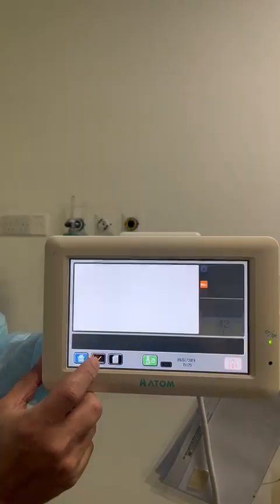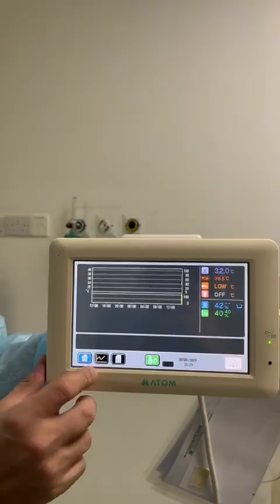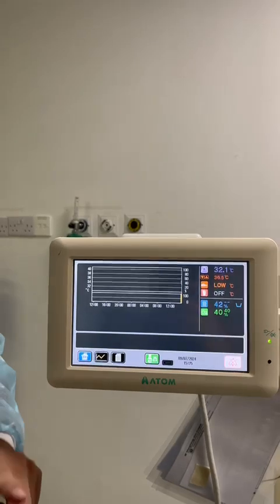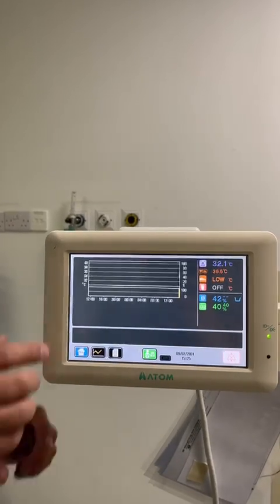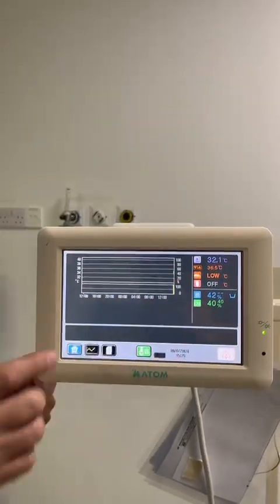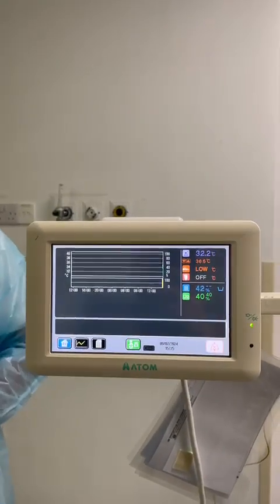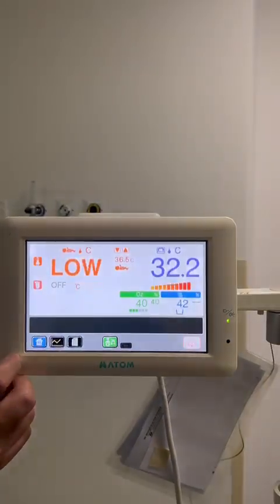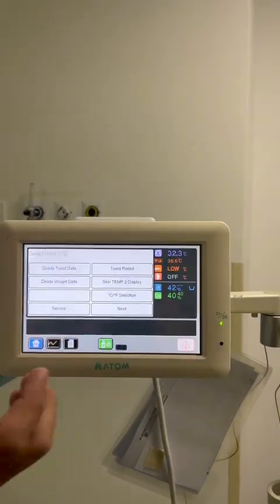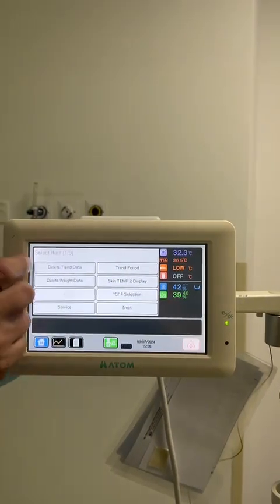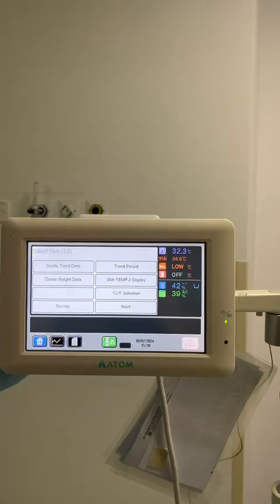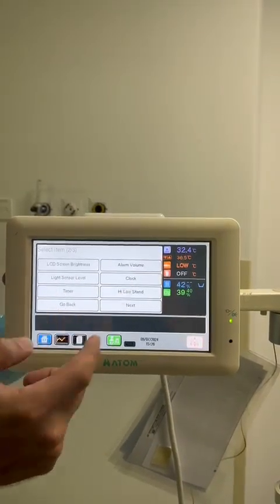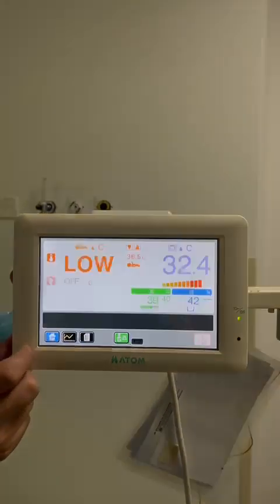This is the trend for the last 24 hours. All parameters — baby temperature, air temperature, humidity, and oxygen — will be recorded here for the last 24 hours. In the menu, you can delete data for the previous baby, adjust the LCD brightness, alarm volume, and clock. That's it — nothing special.